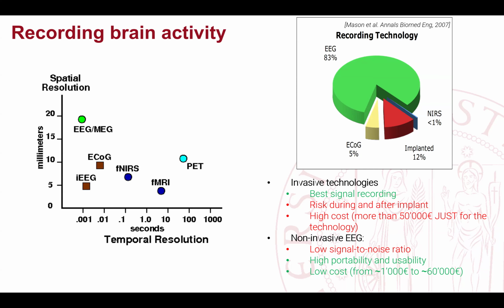So it's like a switcher. It's not really decoding yes or no. It's decoding 1 and 0, and then associating 1 to yes and 0 to no. So it's a switcher. This is the most simple BCI. I mean, you can implement it. If you know a bit of Python programming, you can probably implement it in 1 week. It's very, very simple.